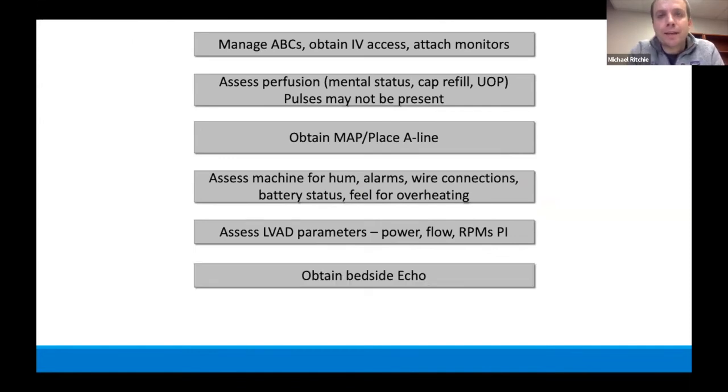Obtaining a bedside echo is really important, and you guys have the ability to do that and feel comfortable doing that. But again, looking at the RV, looking at the LV, the positioning, it can really narrow your differential very, very quickly just by quickly getting a bedside ultrasound on them.